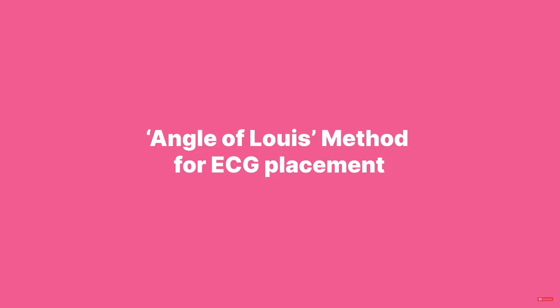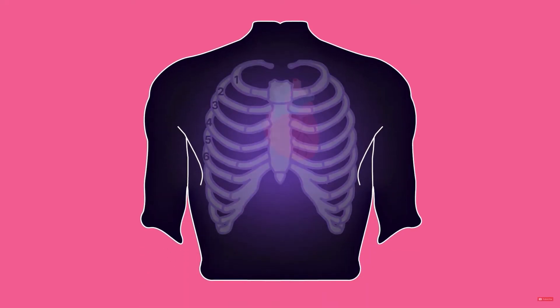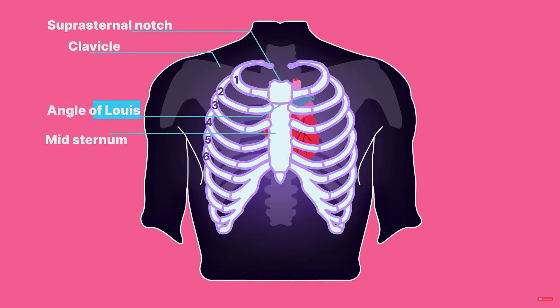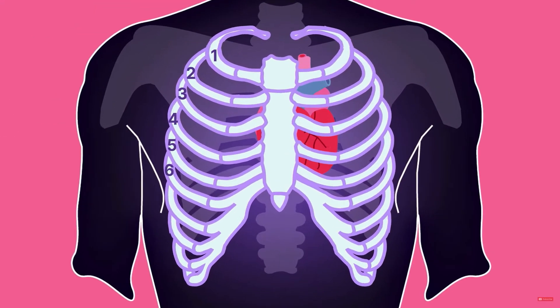Use alcohol to clean each electrode placement site. Using the angle of Louis method, we start at the sternal notch located between the clavicles, then move down the sternum to the angle of Louis — this is where our electrodes are going to go.